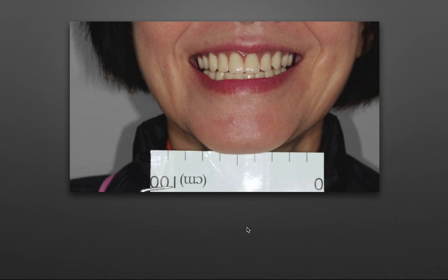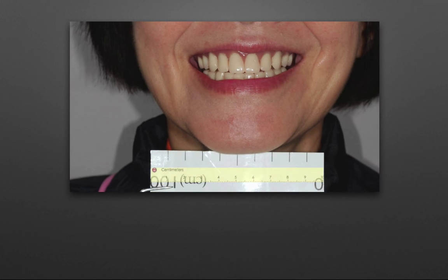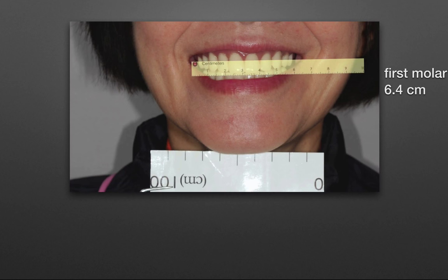Now, let's import a digital ruler. This digital ruler needs to be calibrated to the sample ruler in the smile photo. With this calibrated digital ruler, we can now measure the width of her smile and convey that information to our clinicians.